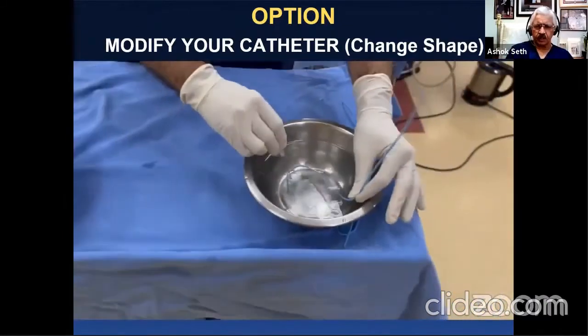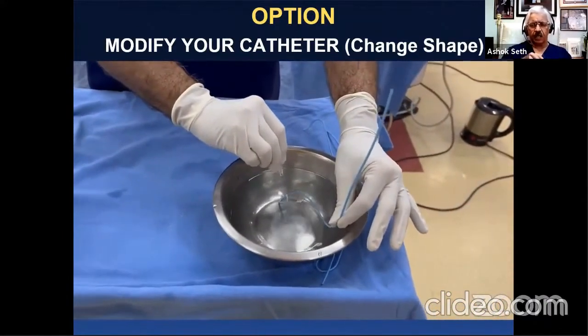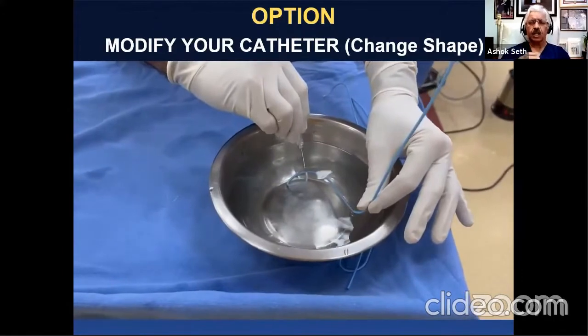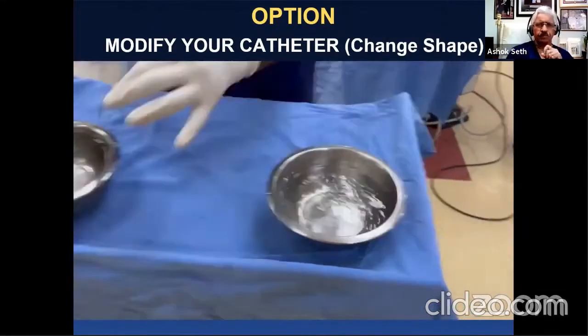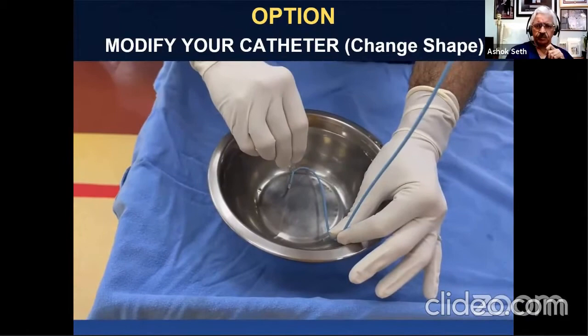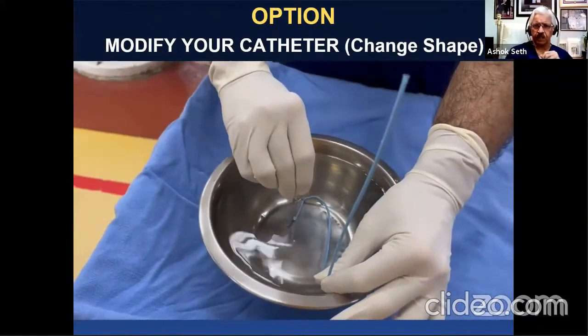So I'm now even changing the bend forwards, mimicking the angle at which it's got to sit into the left coronary sinus, but has to be shaped anteriorly. So the alignment has changed anteriorly. Okay. And I've cooled this enough. That's what I'm saying. And now I'm going to pull this mandrel off.